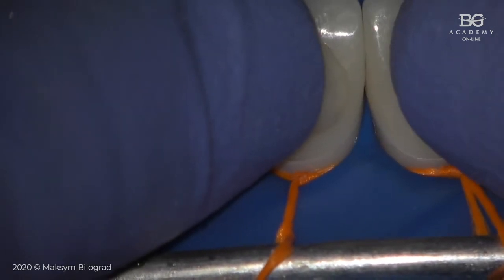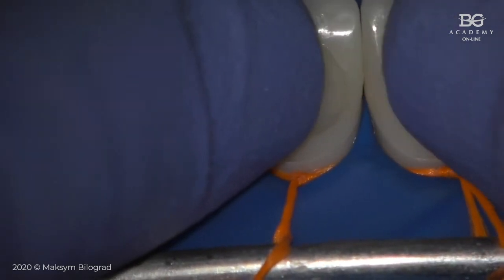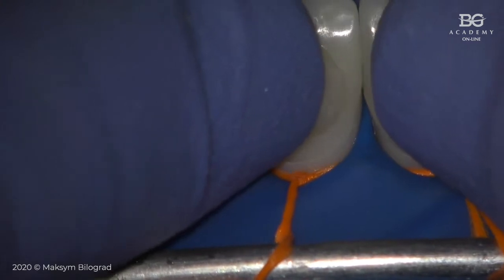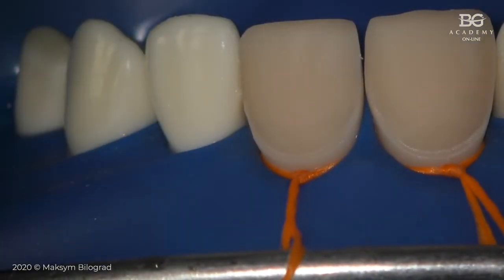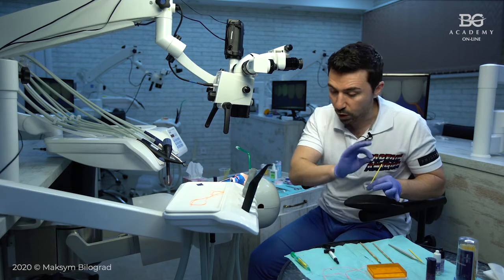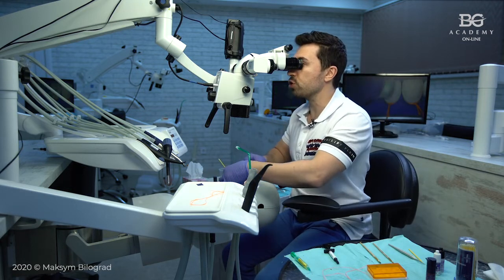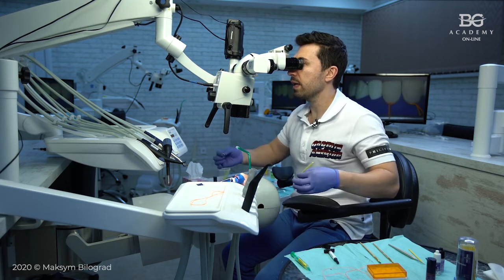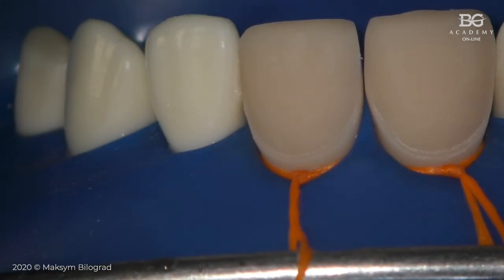If I cannot place 2 veneers at the same time, like this here, I would prefer, in order not to get misplacement, especially on central incisor, to bond 1 central, then another one, okay? And then I can bond 2 laterals, 2 canines, and whatever. But in this case, if I have some doubts and fears regarding placement of my central incisors, I prefer to be really 100% sure regarding the position of 1 veneer, then regarding another one, and then I will bond this one, and then I will show you what will happen later on.